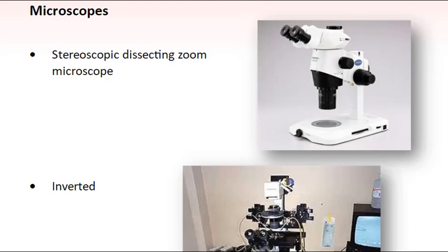The most common kinds of contrast optics include differential interference contrast and Hoffman modulation contrast. Inverted scopes may be retrofitted with additional devices such as a laser for performing assisted hatching and embryo biopsy, or a polarized light microscope for visualization of the spindles inside the egg during ICSI. All of these microscopes may be fitted with cameras for remote visualization of what is on the stage or for photographs. Laser-assisted hatching requires the addition of a camera and computer.